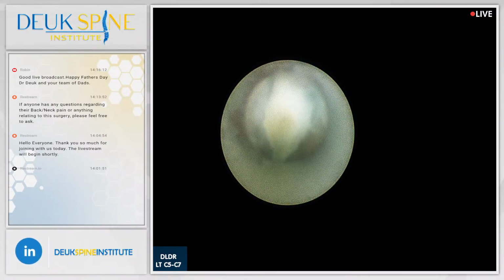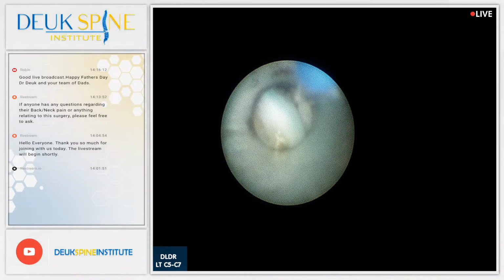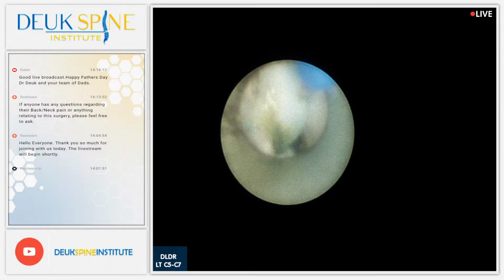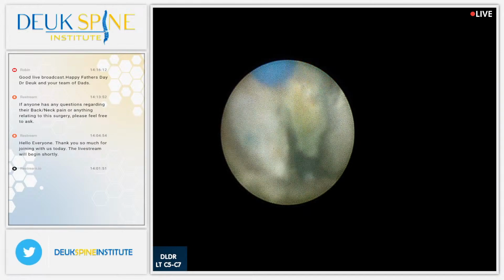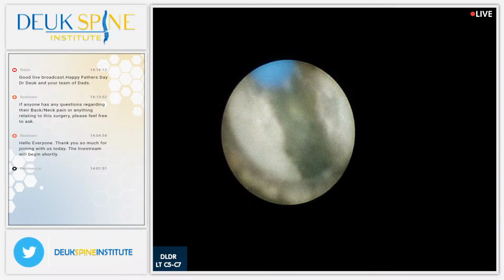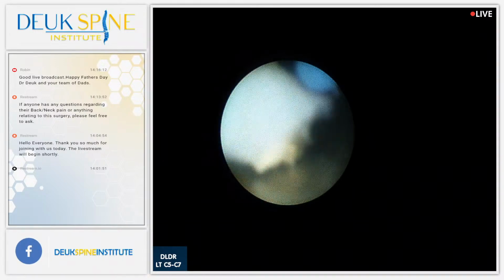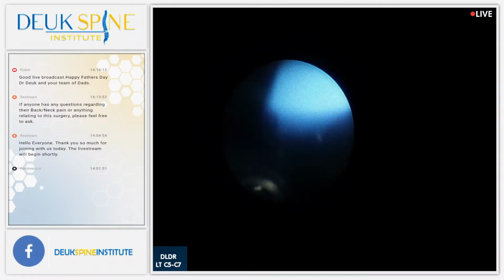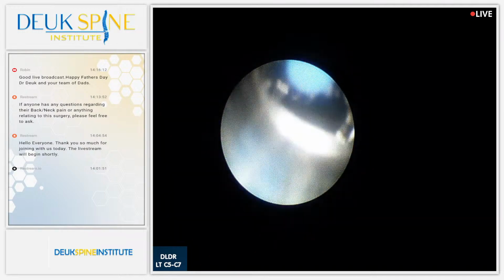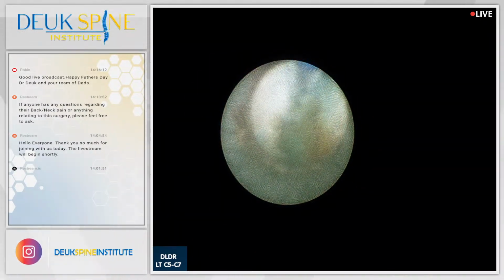Oh, that's a good one. Oh yeah, look at that thing, like a little fish, trying to get away from us. Doesn't want to come out. So that thing is smooth, it's long. It's been there for a while, you can tell, because it's so smooth. Here it comes. Just took it out. And the reason it's smooth is her body has been attacking it.